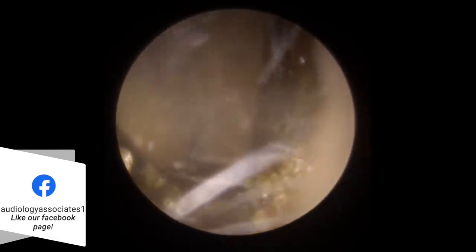You get lots of pops, lots of squeaks in there as well. You can see we're just starting to remove and work on this deeper section. Unfortunately, there's a lot of dry skin in here as well, which has lifted up and embedded into the wax. So it can mean it's a little bit more difficult to remove, and you will get these kind of squeaky sensations as you take the wax into the suction tube, especially with dry skin.